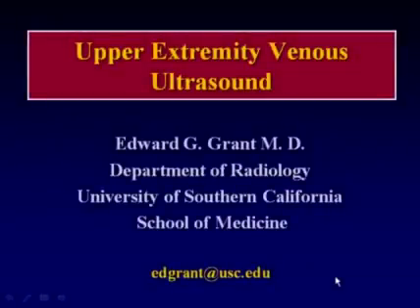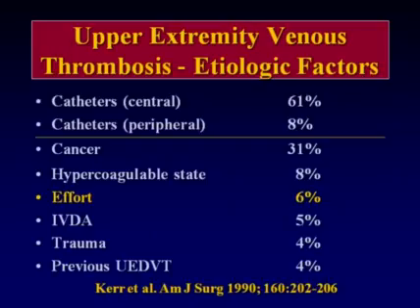Good morning. Today I'm going to be talking about the upper extremity venous ultrasound examination, and in particular I'm going to emphasize its use in the evaluation of both acute and chronic venous disease.